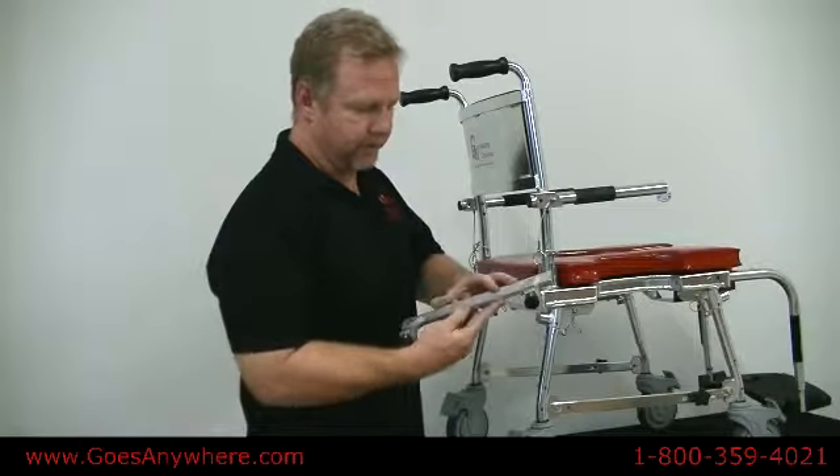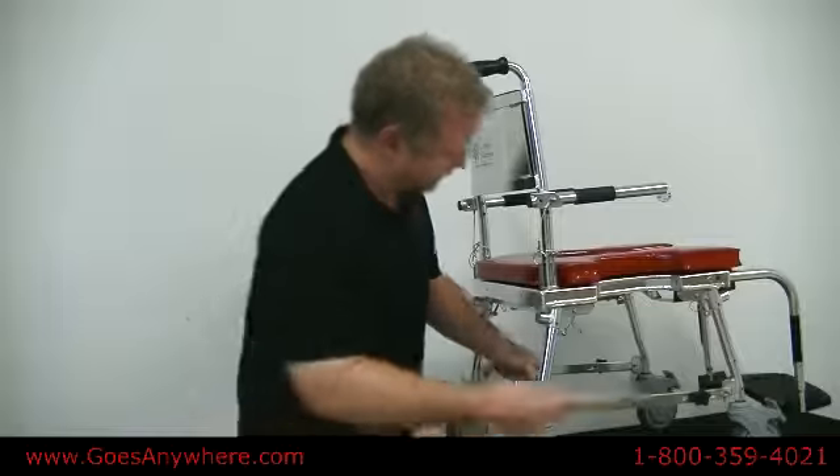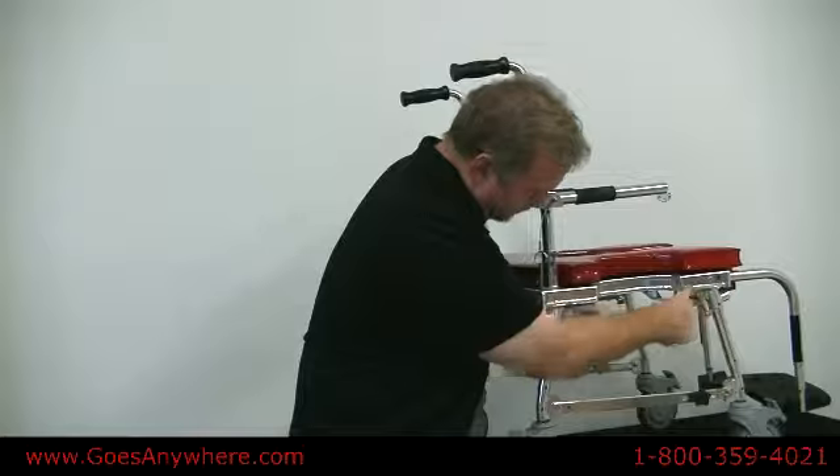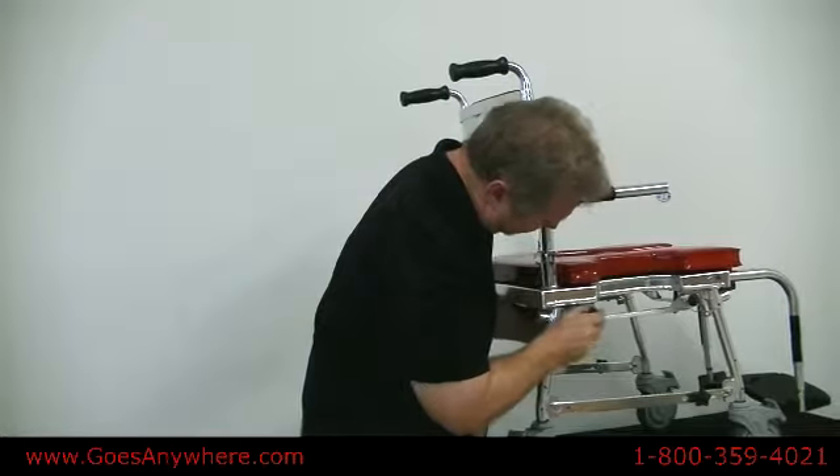Installing your commode tray — these are the commode rails. They install underneath the chair with the knobs facing out.